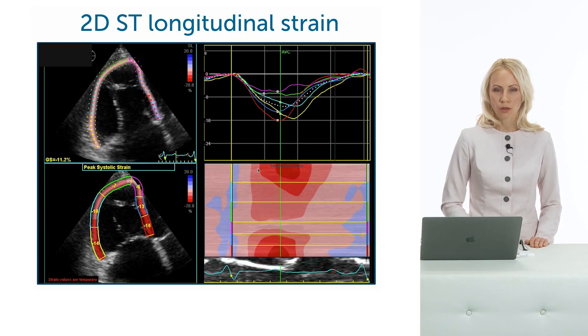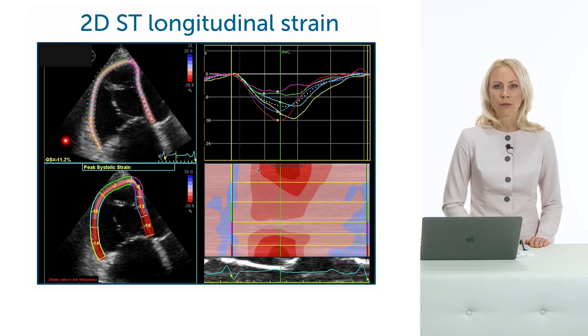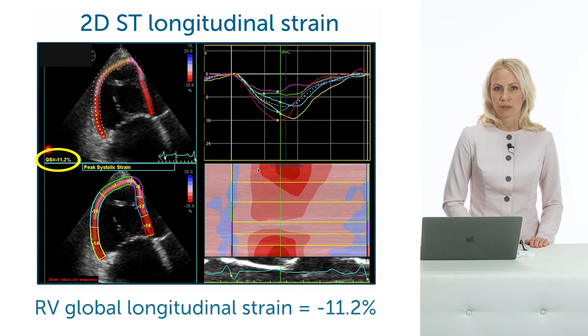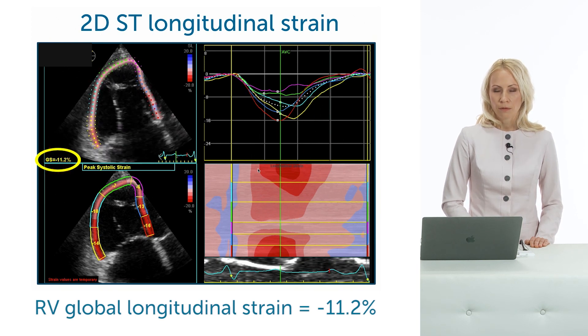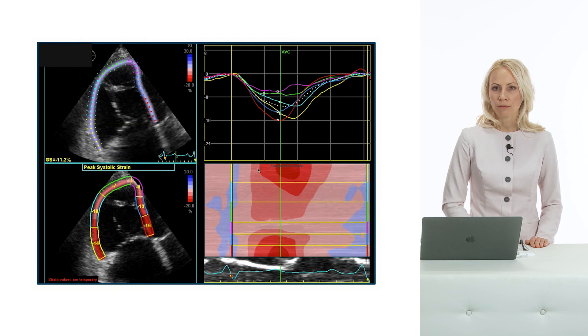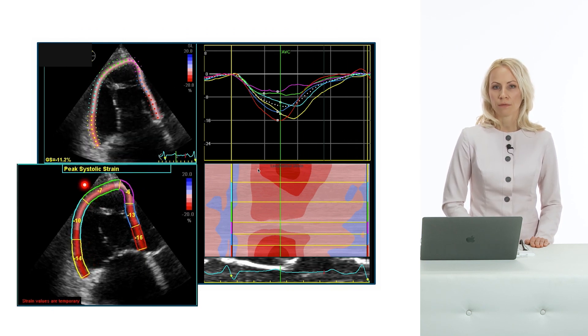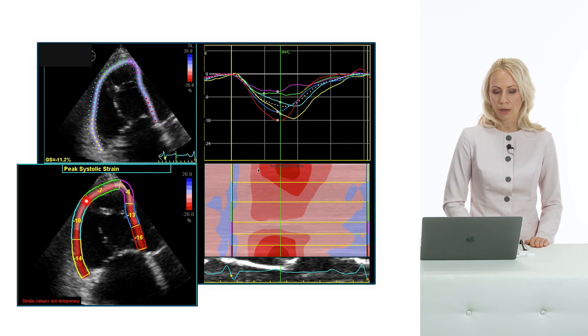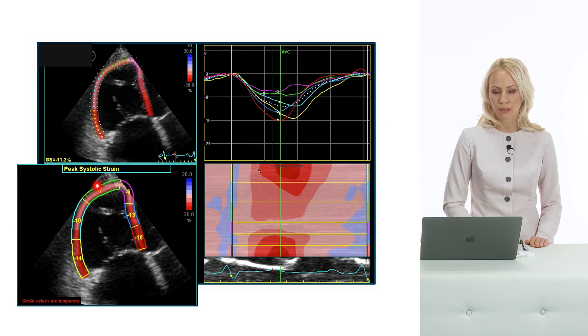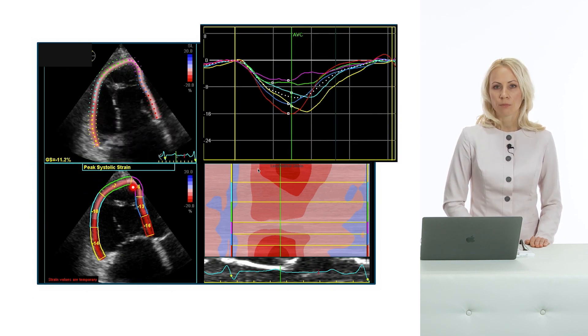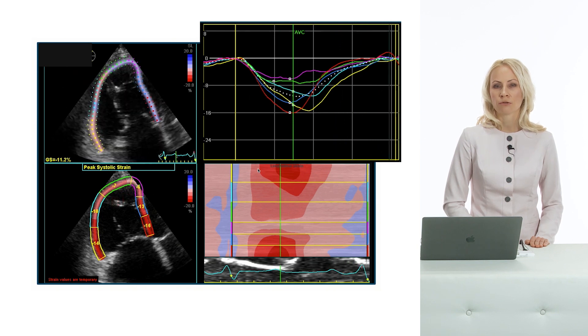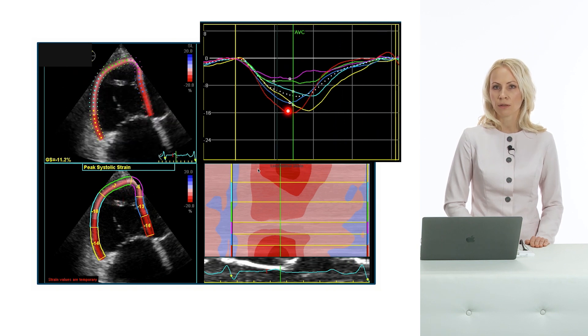Moving to RV strain analysis, the global longitudinal strain is minus 11%, which is significantly reduced. The segmental values show that especially in the apical parts of the RV free wall and septum, values are very low at minus 7 and minus 6. We can also appreciate from the curves that the contraction of the right ventricle is dyssynchronous.